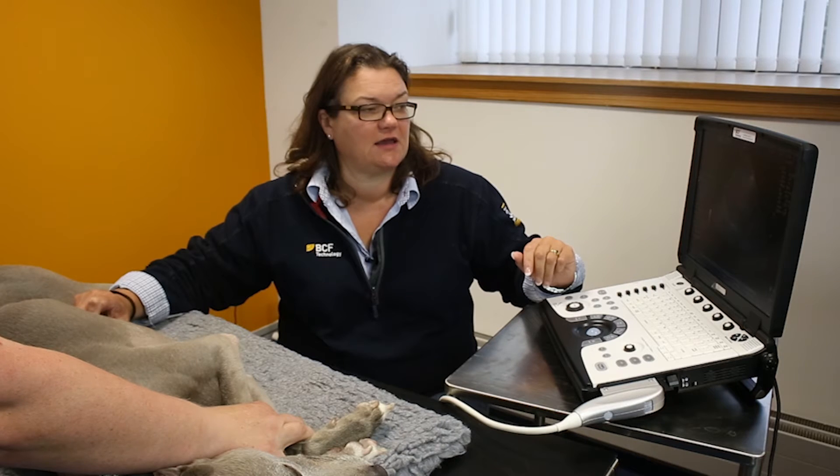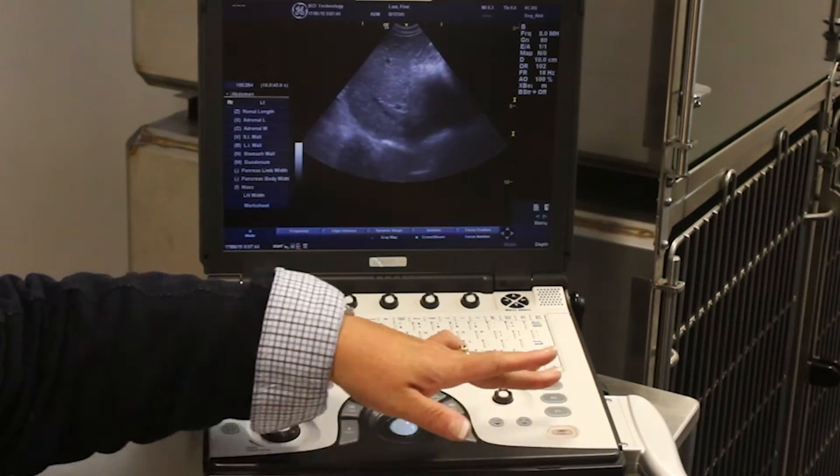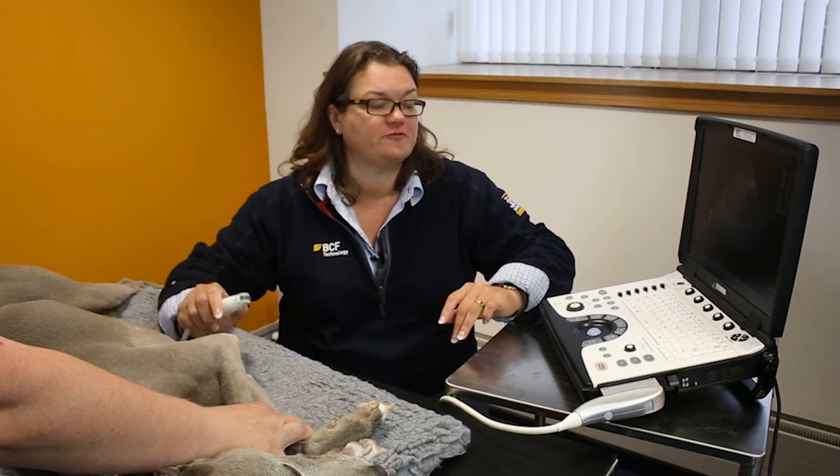When you've got an image that you like, you hit freeze, and very often just as you hit freeze, you've missed a nanosecond — the perfect image that you had just before you hit the button.